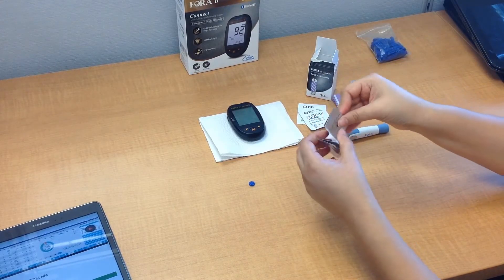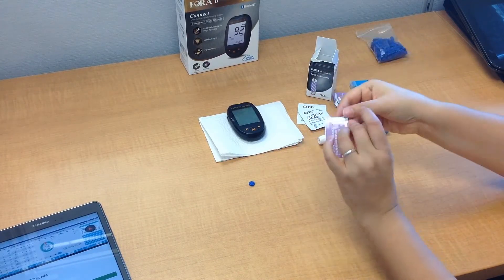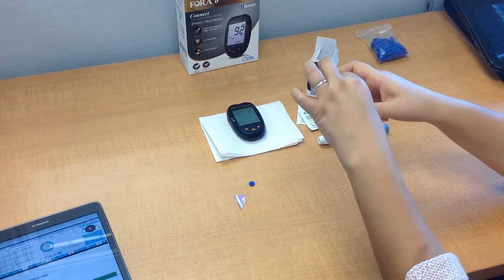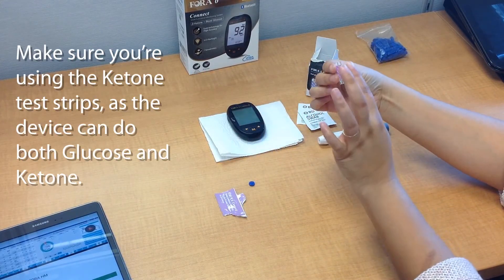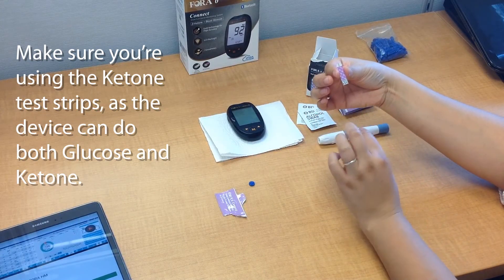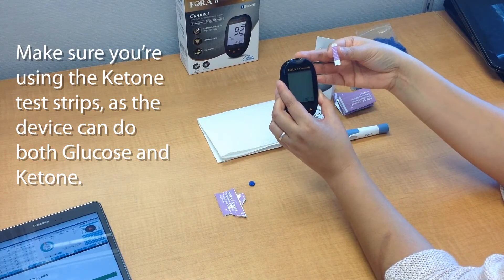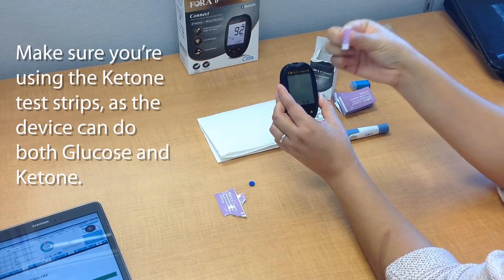With the meter turned off, let's take an individually wrapped test strip and open it. This is what the strip looks like — the purple test strip that says KB on it — that's the ketone test strip. It's important to remember that this device also does blood glucose, and the blood glucose test strips are separate and look different. So make sure that if you're doing a ketone test, you're using the right test strip.